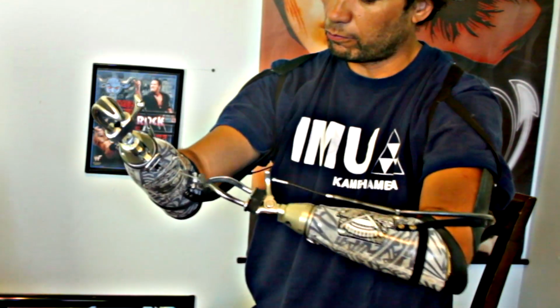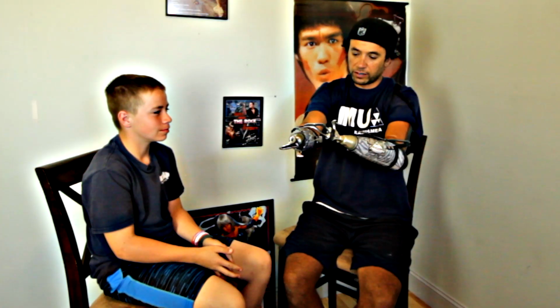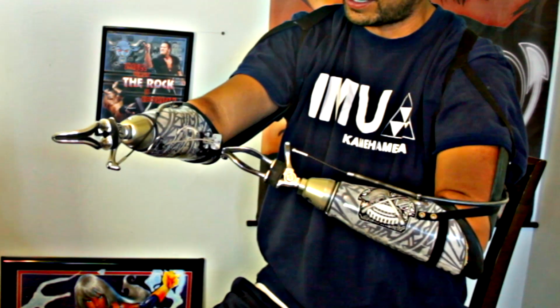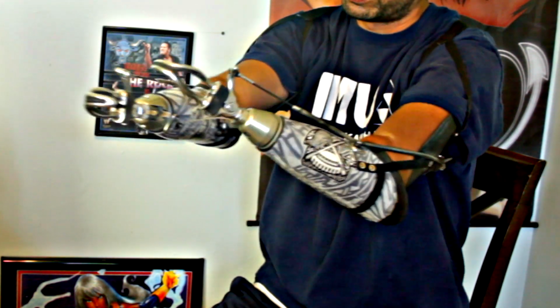Now, when I want to pull that hook back towards me, because the spring is loaded to spin this way, I have to release the lock and push out, and that string will pull it straight in line. So that's how these work.